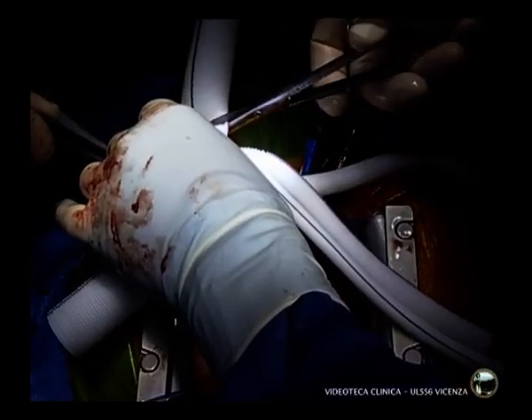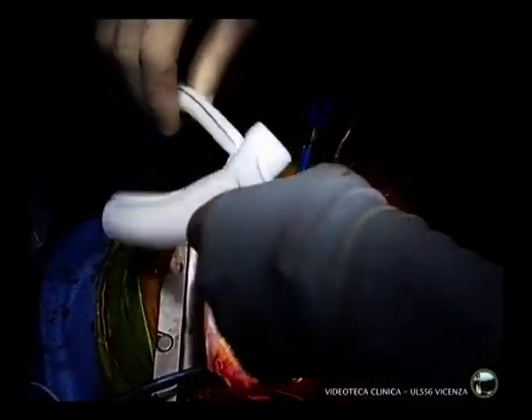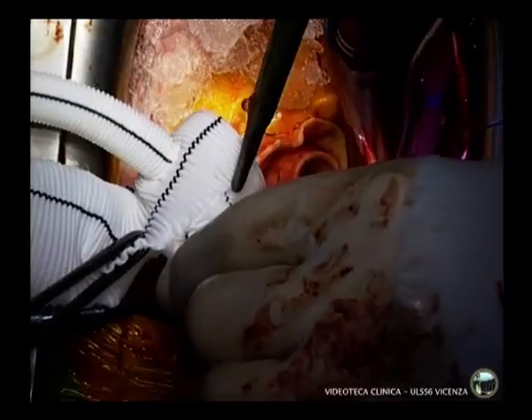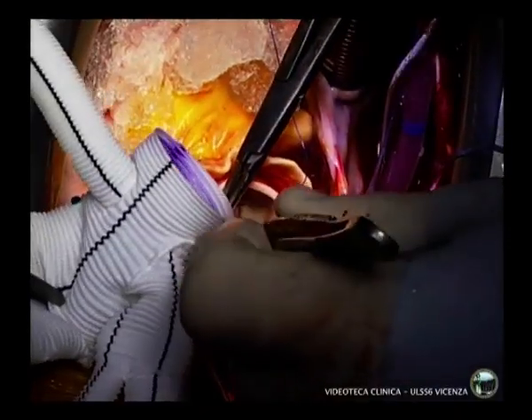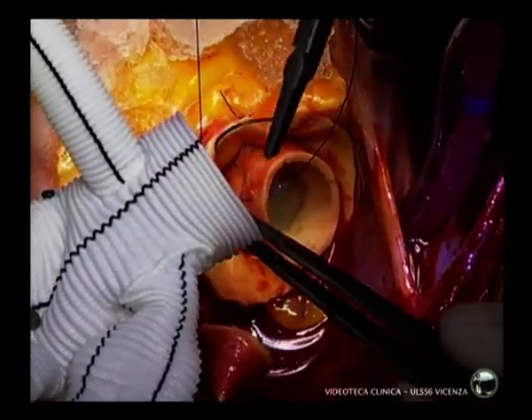Preparation of the vascular graft Lupia Vascutek number 28. Preparation of the proximal anastomosis, taking care with the orientation of the vascular graft towards the superior aortic trunk.